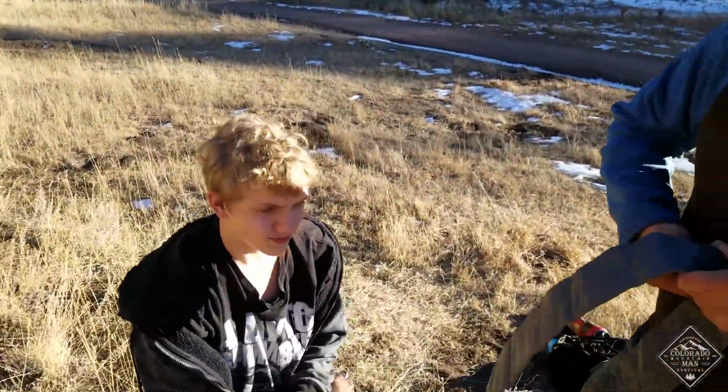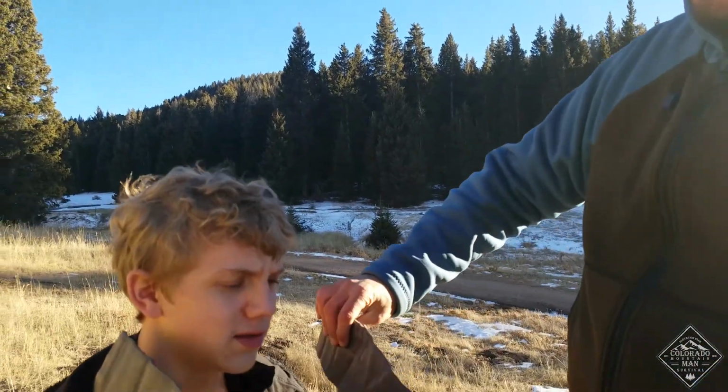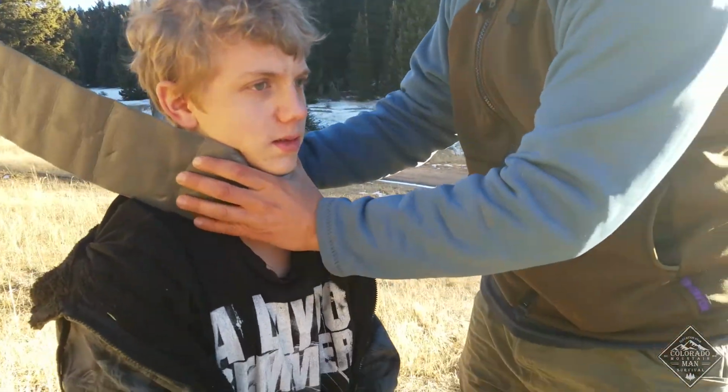You good? Yep. All right, so it's totally okay to take a few times to put it on him and take it off and size it. It's better to get it the right size and have it look all janky, and people wonder what the hell you're doing. So right up here, his neck fits kind of in that indentation.